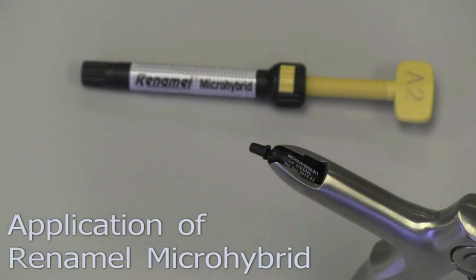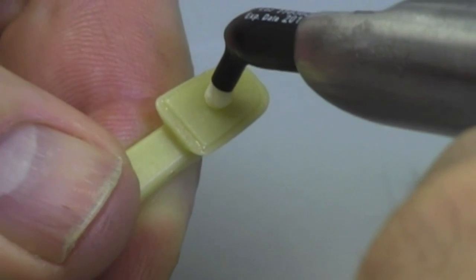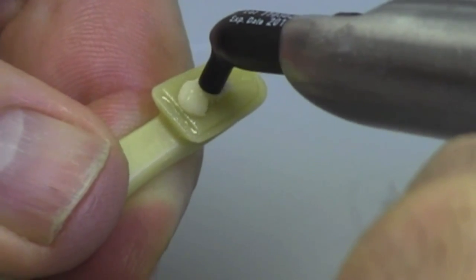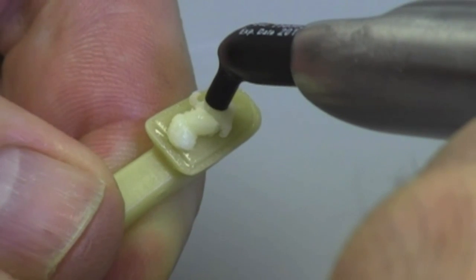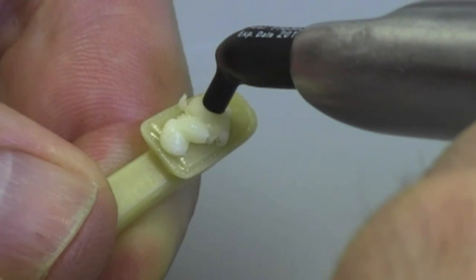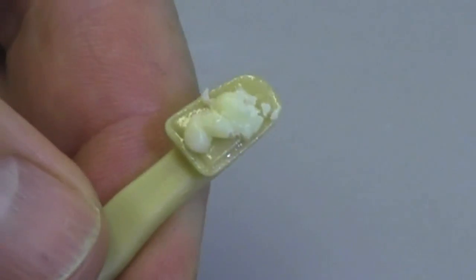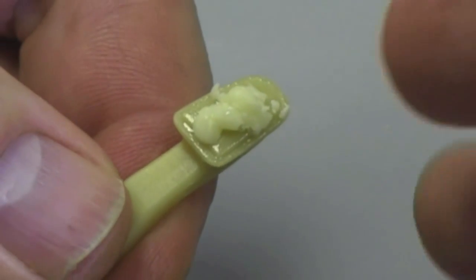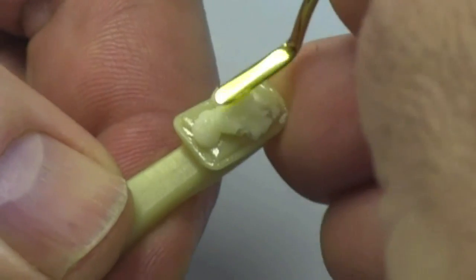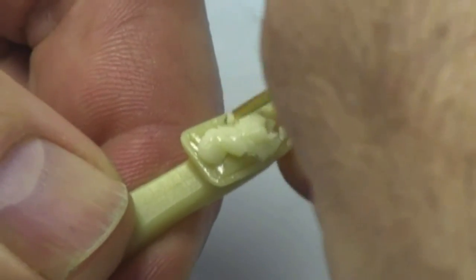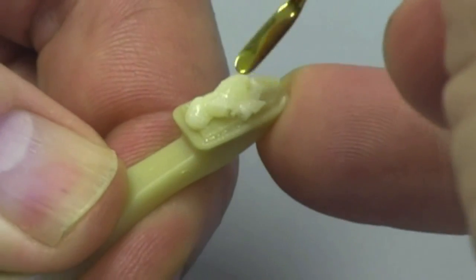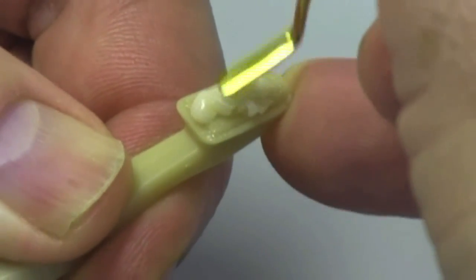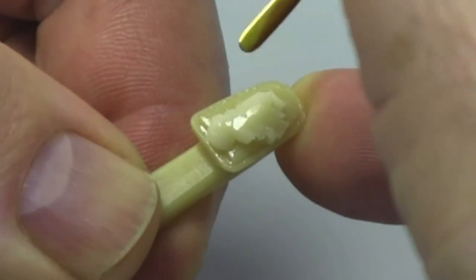One of my favorite composites to use is Cosmodent's Renamel Microhybrid. When this material is dispensed from the Compuel, one of the things that you'll almost always notice is that it appears to be very chalky. This is just the very initial appearance because as soon as you begin to manipulate the material, it begins to have a viscosity that actually will allow it to flow just enough to be extremely adaptable to the underlying tooth surface.